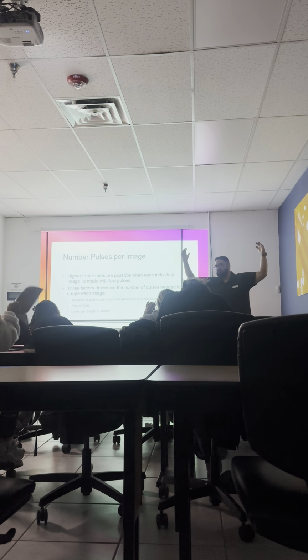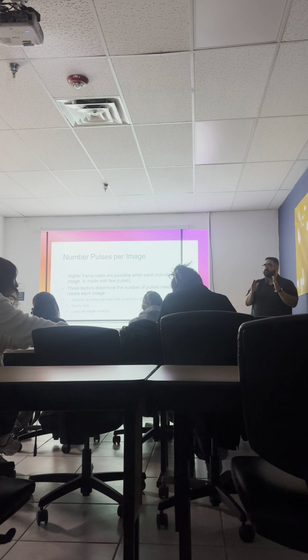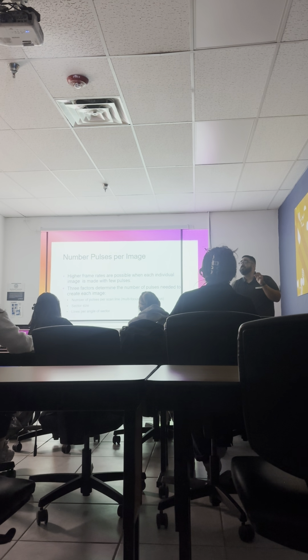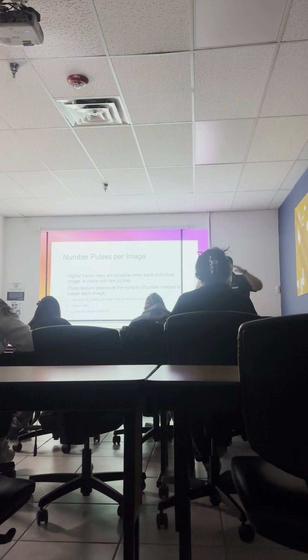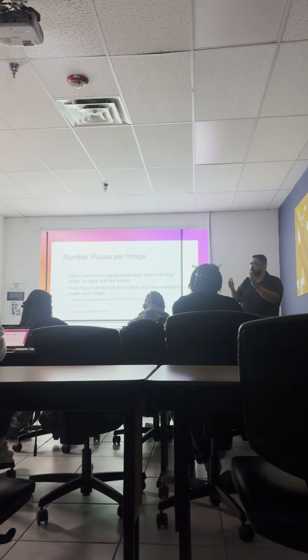bigger. Okay, so we can make it to where it's a smaller sector size. So what would be the benefit of having a smaller sector size? A higher resolution. What type of resolution? Temporal resolution, okay, temporal resolution. Because instead of having to use, let's say, 100 scan lines to make our normal image, we're making it smaller so it has less scan lines. So instead of 100, we have 50. So we improved the temporal resolution by 50%, because we got rid of some scan lines.